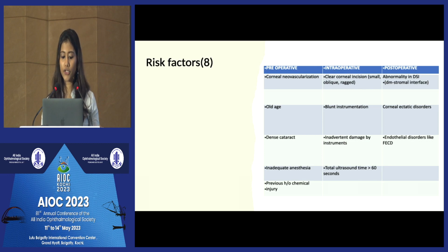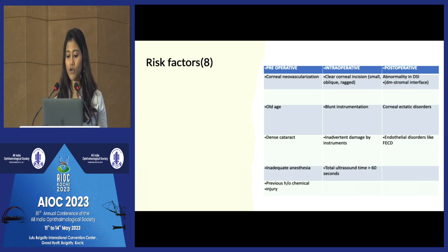or frequent instrumentation, any inadvertent damage by the instruments, and in case of phaco, when the ultrasound time exceeds more than 60 seconds. Post-operatively, if there is any abnormality in the Descemet membrane stromal interface, any corneal ectatic disorders or endothelial disorders such as Fuchs.